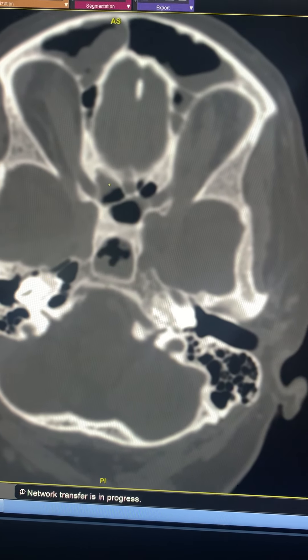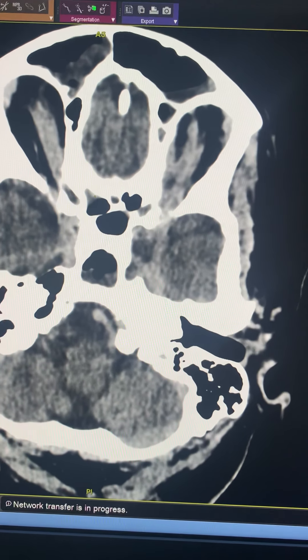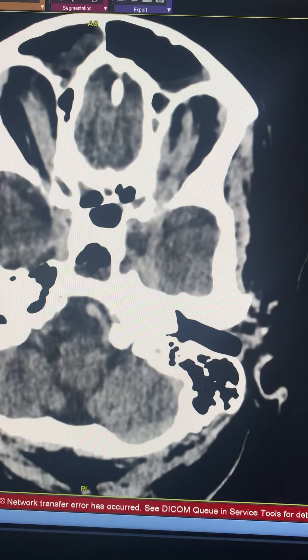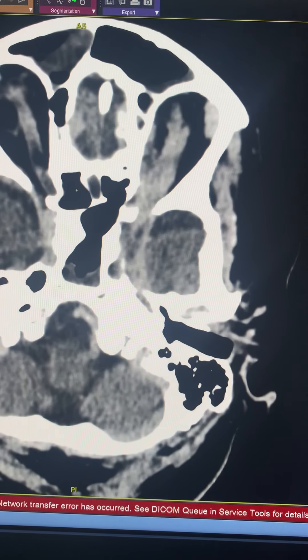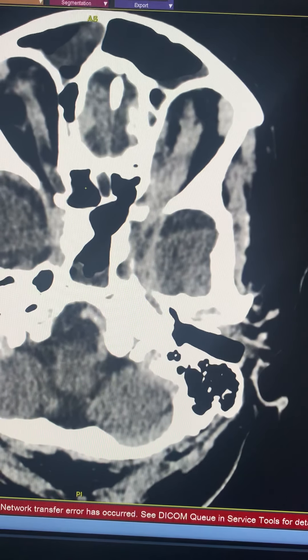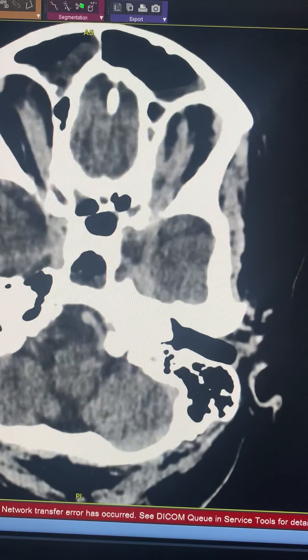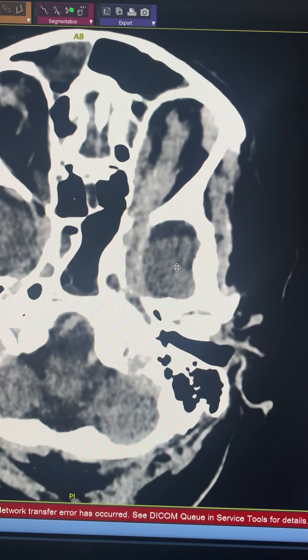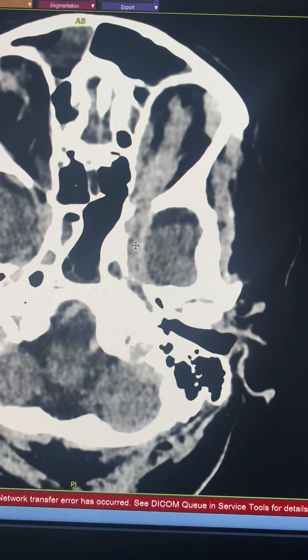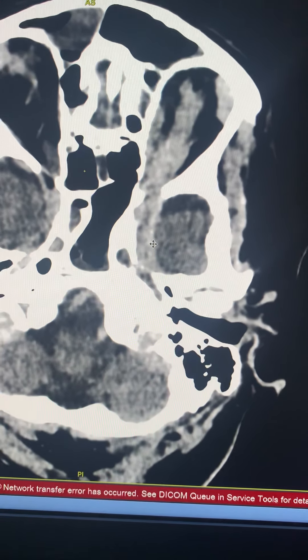Moving to bone window settings, we can see that the left orbital apex is widened. There is soft tissue extending from the orbital apex posteriorly intracranially into the intracranial extradural space in the left temporal region.